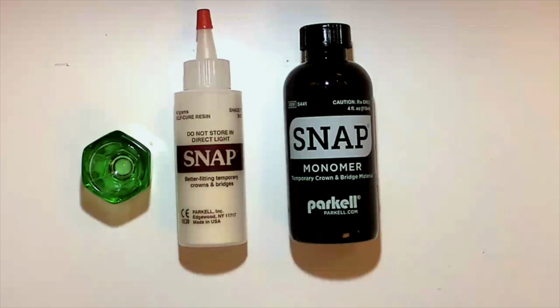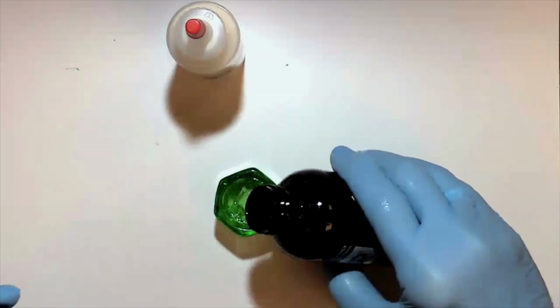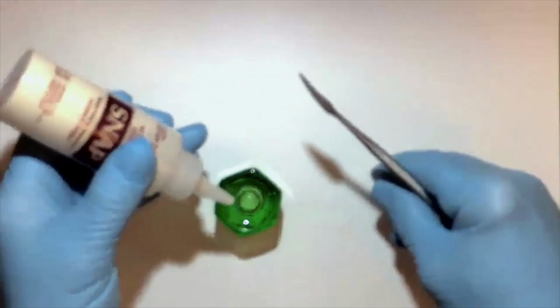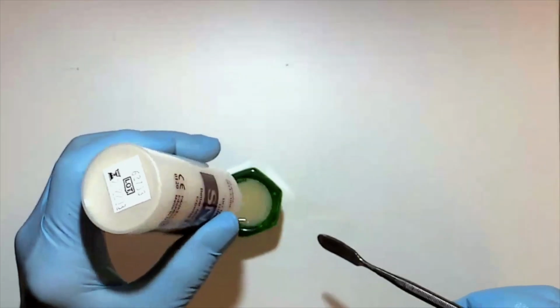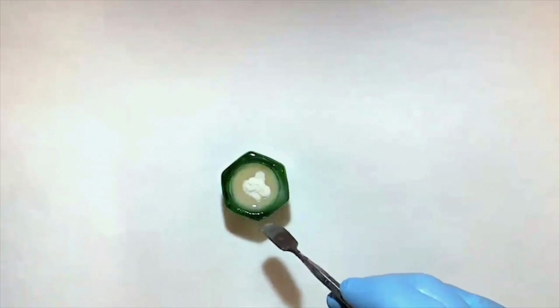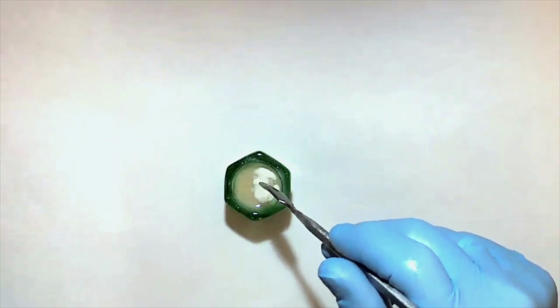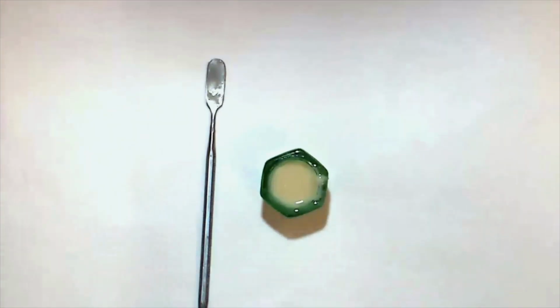Next, we'll be mixing our acrylic, the Snap liquid and powder, in a dappen dish. We'll add our liquid to the dappen dish and then add our powder gradually till we get the proper consistency. When the acrylic reaches a doughy-like consistency after perhaps 1 to 2 minutes, we can then remove it from the dappen dish and place it on the articulator.